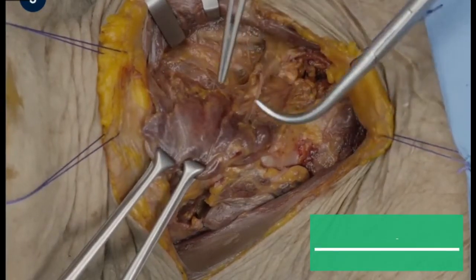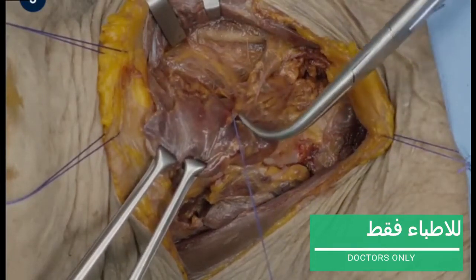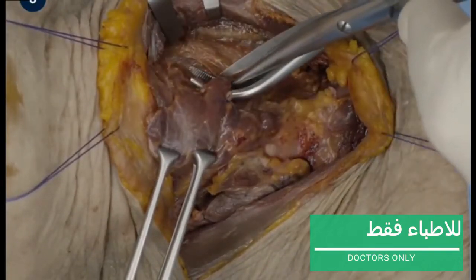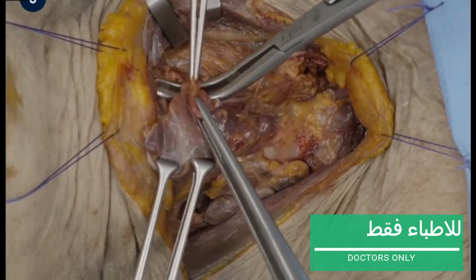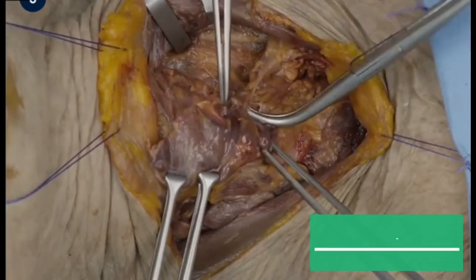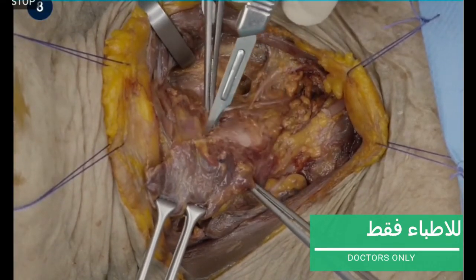The recurrent laryngeal nerve is localized again when starting the lower pole mobilization. The inferior thyroid artery is ligated. This is the tubercle of Zuckerkandl, which is resected with the thyroid gland. Now the entry point of the recurrent laryngeal nerve into the thyroid cartilage is visible. The trachea is visualized and this is the direction of the dissection, which can be performed with scissors or with a knife.